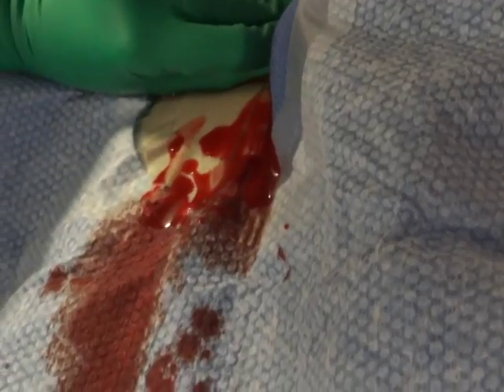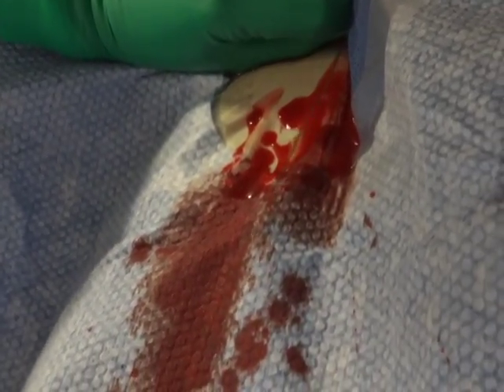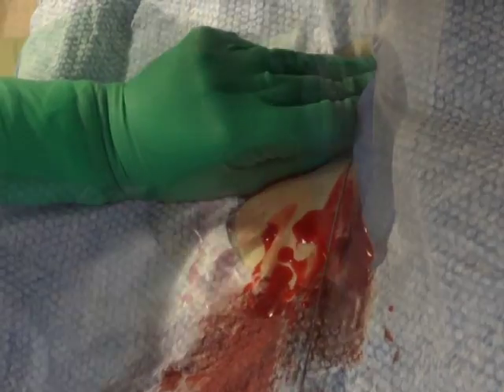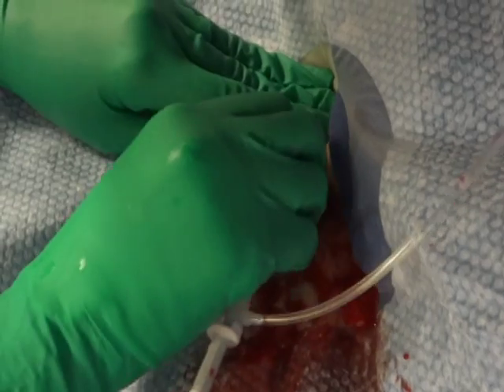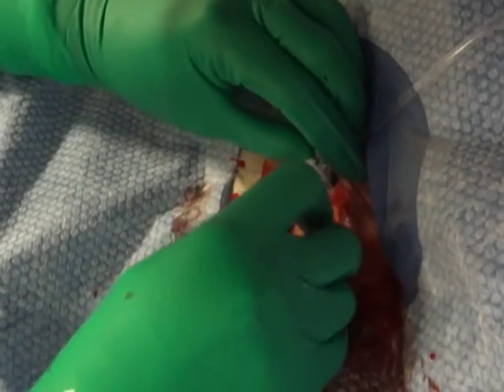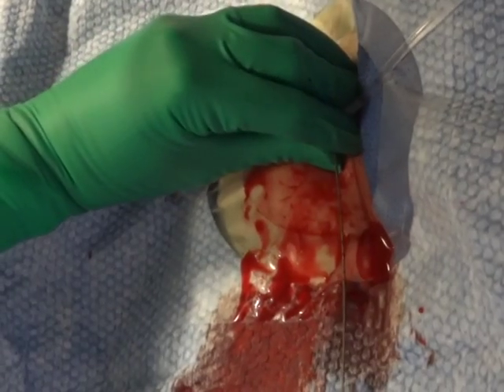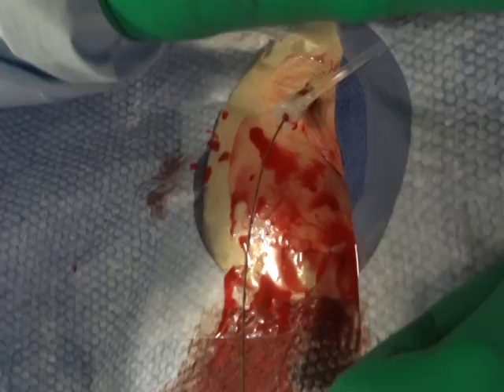Once the guide wire is advanced through the artery, fix the wire with 1 hand and remove the needle. Insert the catheter sheath with dilator along the guide wire. Once the guide wire and dilator are removed, the catheter can be advanced through the catheter sheath.